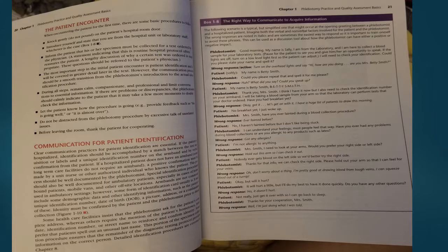Special identification procedures should also be well documented for ambulatory patients, especially in the case of homebound patients, mobile vans, and other off-site locations. Armbands are not commonly used in ambulatory settings. However, some form of identification card usually is. It may include some demographic data and other identifying information such as the patient's unique identification number, date of birth, a picture, address, or a combination of these. Identity must be confirmed by the patient and the phlebotomist prior to the blood collection.